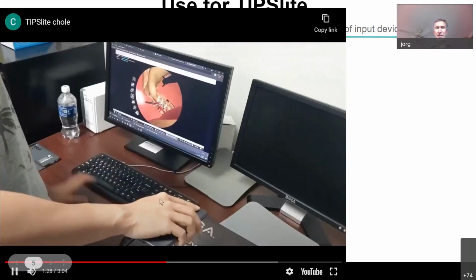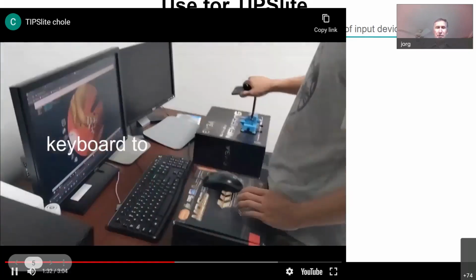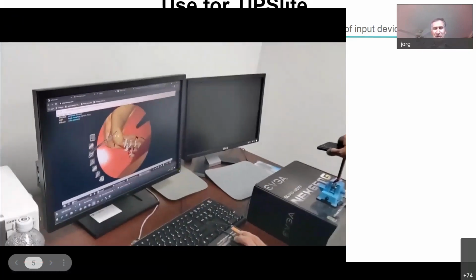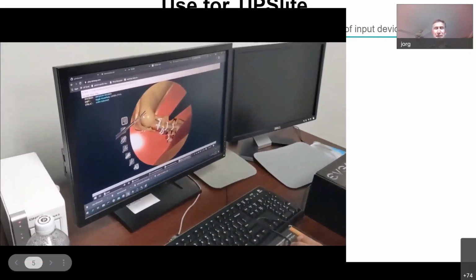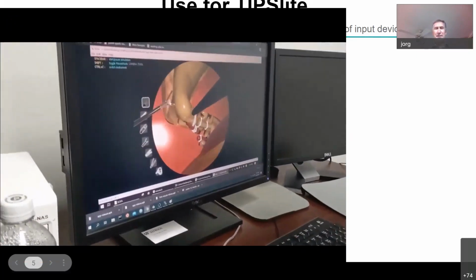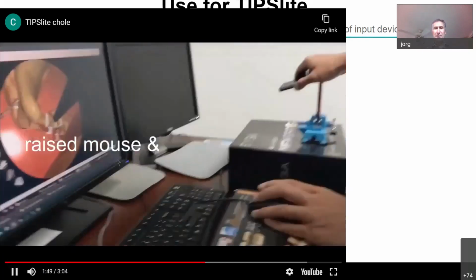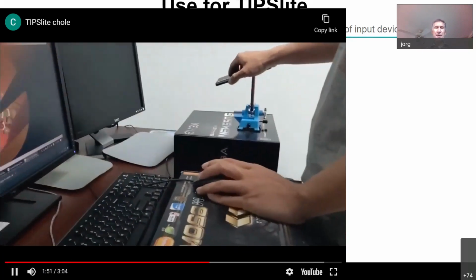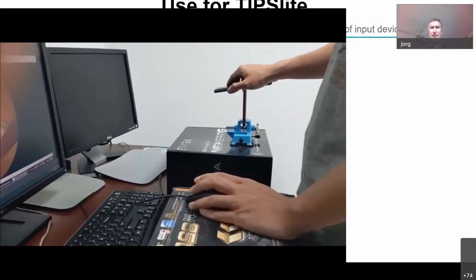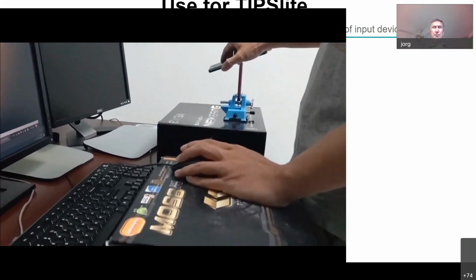So basically, you see on the screen everything moves together with this here, and now we ergonomically improved it by putting some graphics card boxes underneath. That makes it work much better because it has the right angle for your arm. And so usually people don't have two cell phones, and so we use the mouse as the weak hand. And that typically takes the other clamp that can retract fatty tissue so that you can expose it and then tear it or cauterize it.